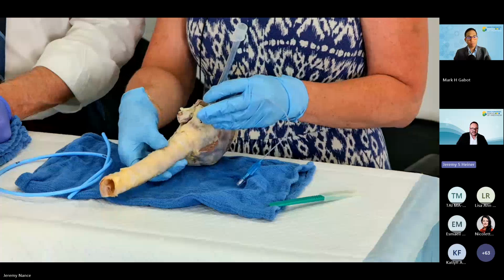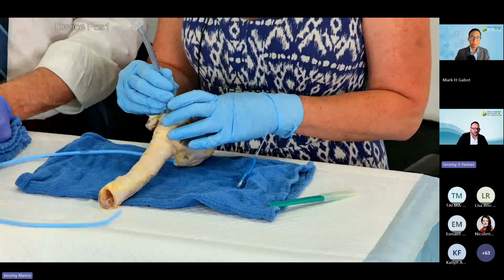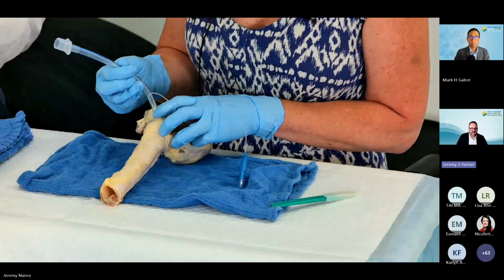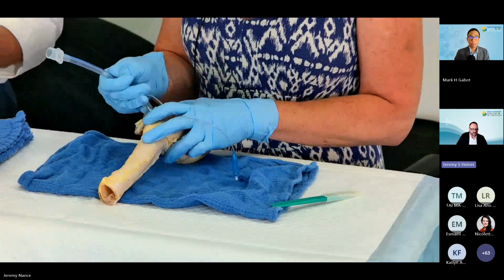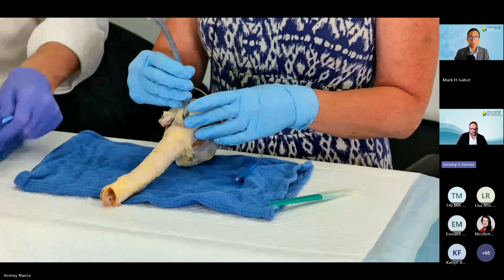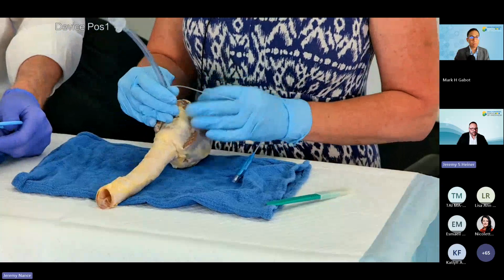Once you see that cuff disappear through the incision, you don't have to go too much farther. It's about 10, 12 centimeters of depth. So once you see that cuff disappear, then you're going to stop, because you don't want to main stem intubate the patient. Awesome. So that's at 10. Yep, there you go. Perfect. We don't see the cuff at all.